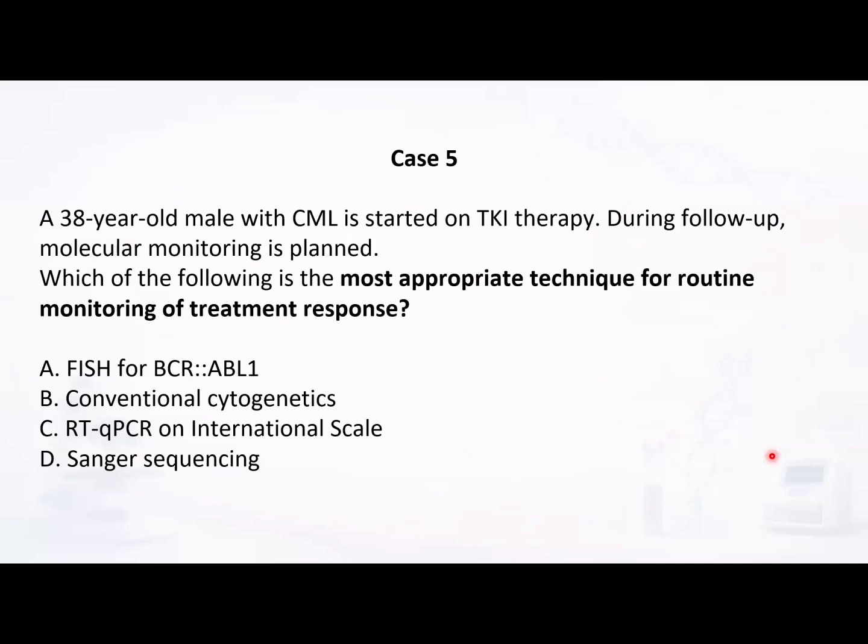With CML started on TKI, what is the most appropriate technique for routine monitoring of treatment response? Anybody? RT-qPCR. Correct. That is good. Another question would be, can any other technique be used for monitoring of treatment response?